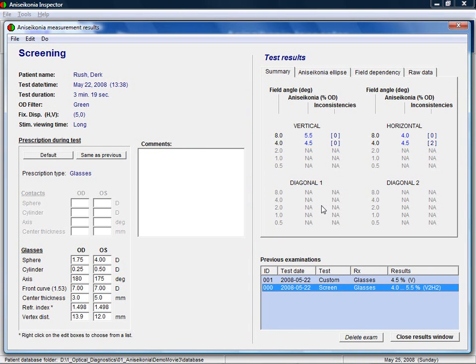On the right side, you can see the result summary. The aniseikonia has been tested in different directions and for different field angles. Different field angles means that the rectangles were on average of different size and so different parts of the retina were tested.